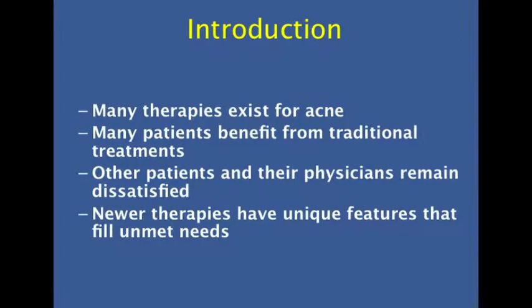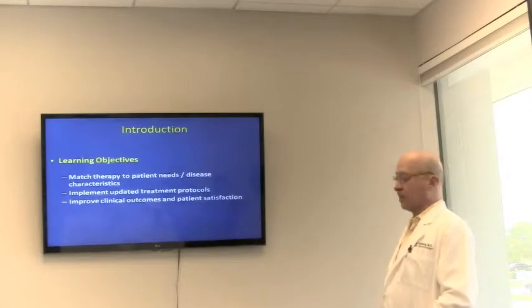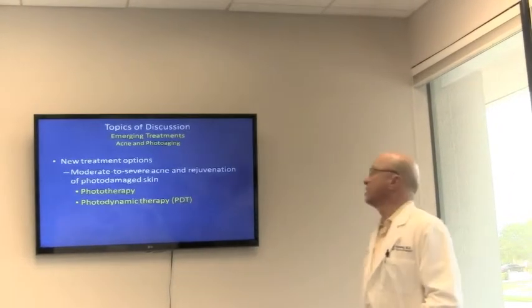So, we're going to try to think about matching therapy to patient needs and disease characteristics, which means a 14-year-old that's got a few blackheads and whiteheads does not need PDT. Go through what we use as our treatment protocol north, and I think it's very applicable here, and try to get better clinical outcomes and patient satisfaction by focusing on some of the nuances.